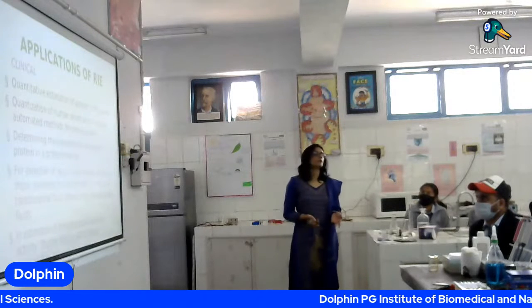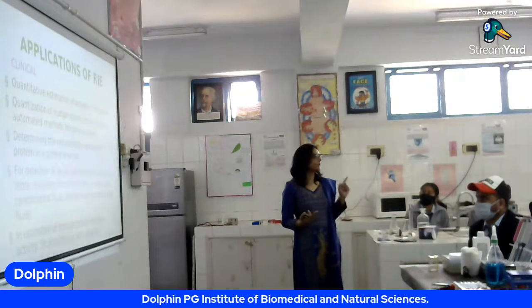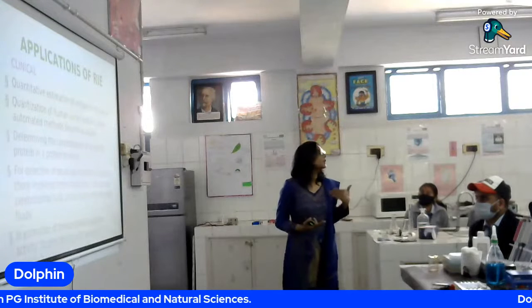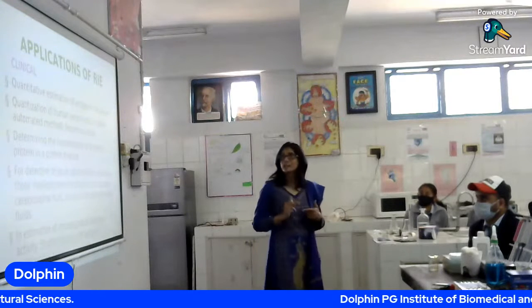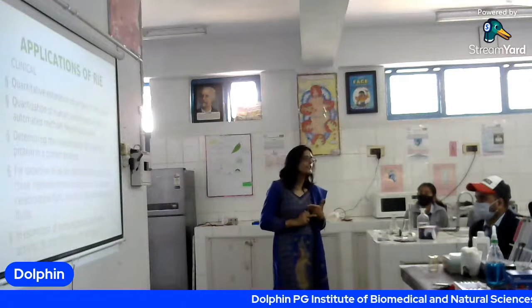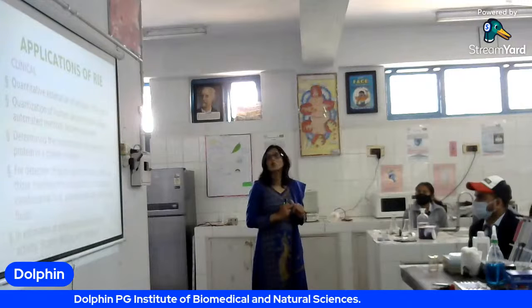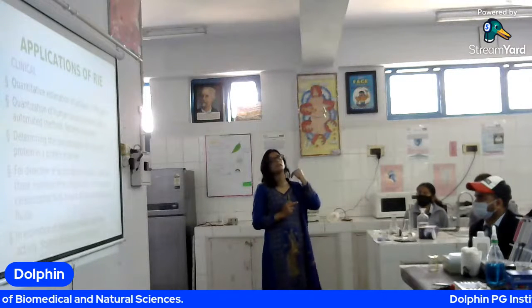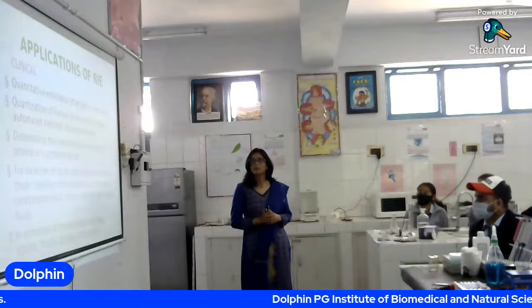Now, why to do this technique? What is the application? As you saw, what was its historical importance? It was used for the quantification of a virus present in the chicken. In the present context, we can do it for the qualitative as well as for the quantitative analysis. We can quantify different serum proteins. We can determine the concentration of specific protein in sample.